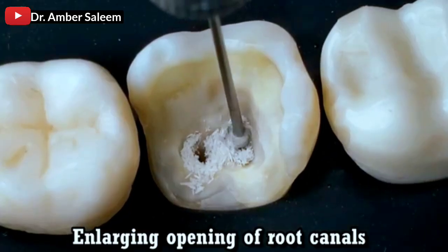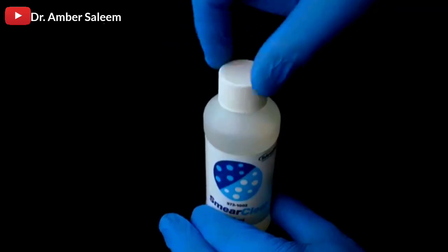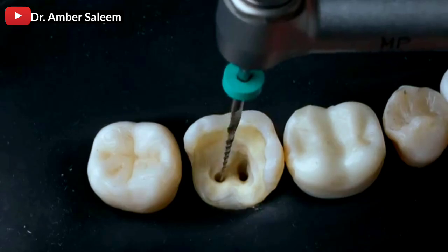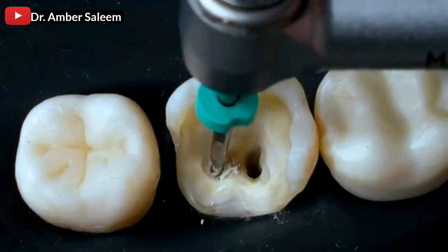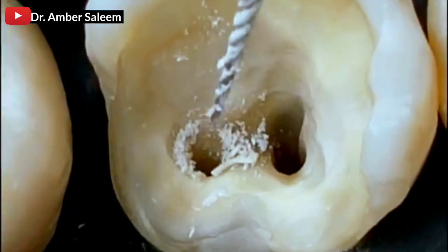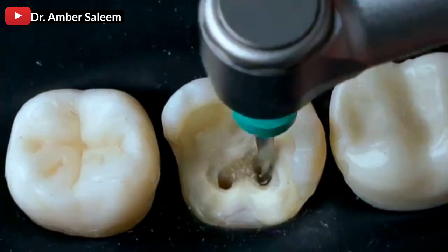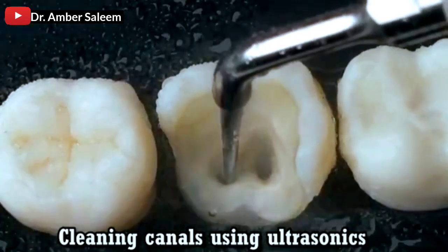Enlarging the opening of the root canals. Cleaning and disinfecting the root canals. Shaping all three root canals to the measured root apex. Cleaning canals using ultrasonics.